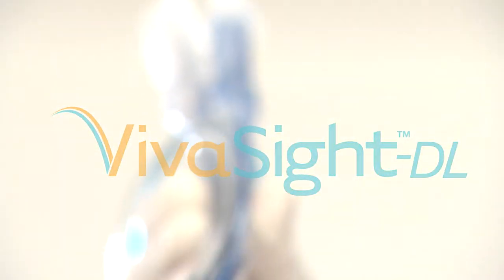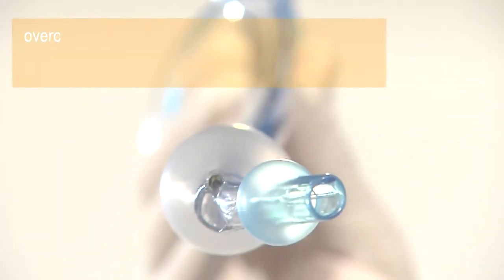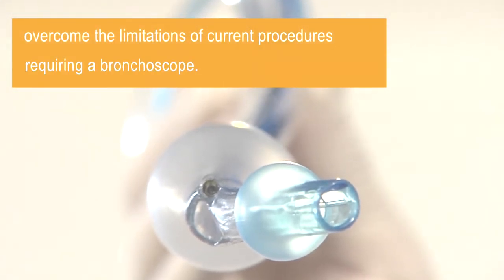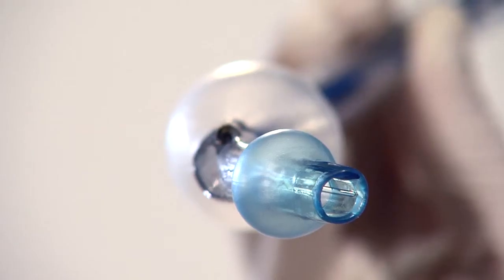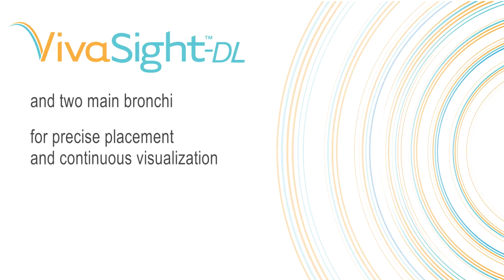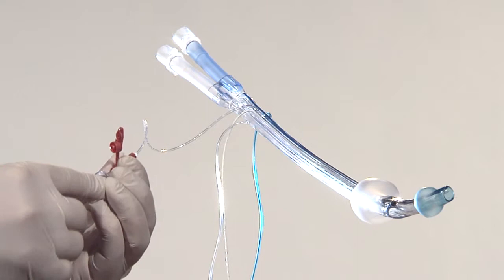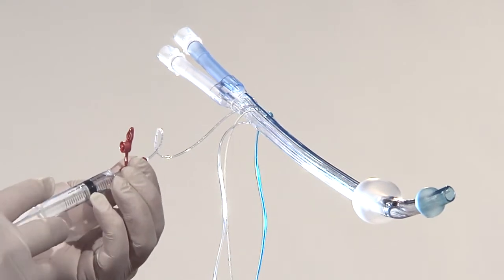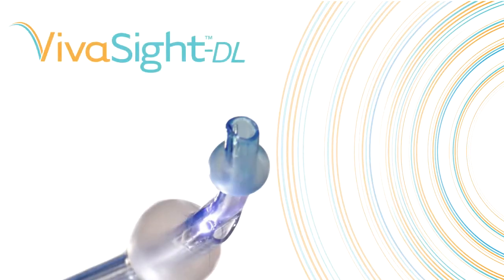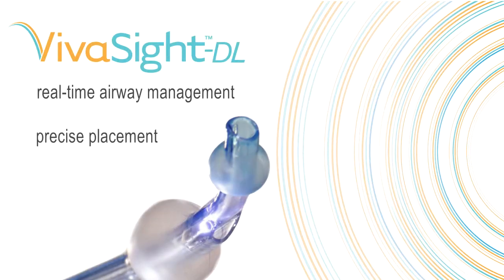The VivaSight DL integrates two important features to overcome the limitations of current procedures requiring a bronchoscope. The high-resolution CMOS camera gives the anesthesiologist uninterrupted observation of the trachea, carina and two main bronchi for precise placement and continuous visualization. The innovative flushing system enables cleaning the camera lens without removing the tube, giving the anesthesiologist real-time airway management, precise placement and continuous control.